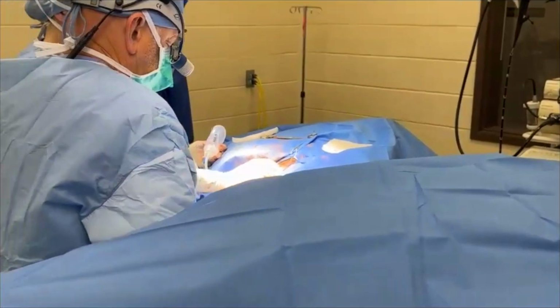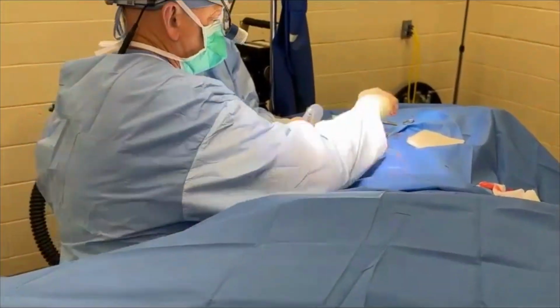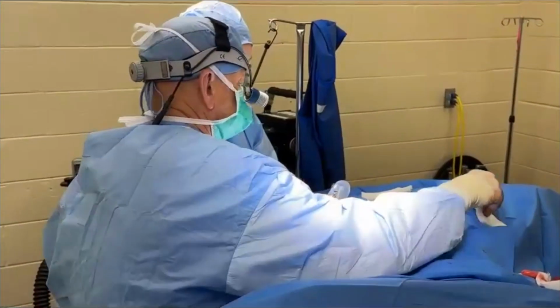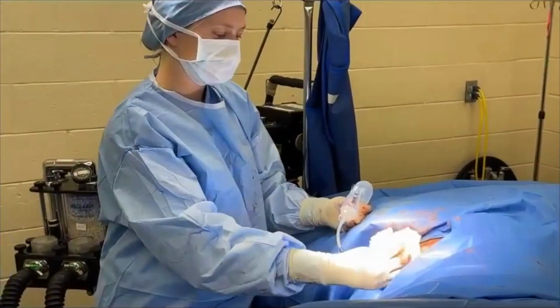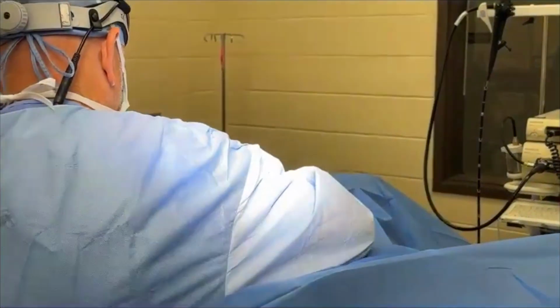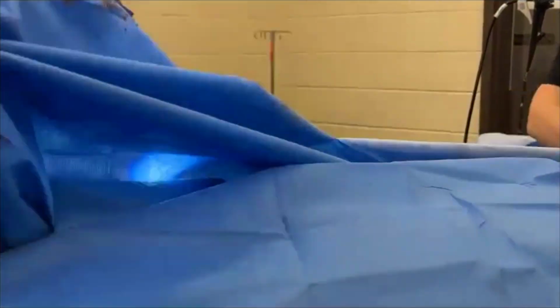Yeah. So we put this suction device on that little tube that you saw. You can see that little plastic thing in her left hand. It's just a thing you squeeze, and then it's got suction in it. Then we usually put just a Coverderm Band-Aid kind of over the incision for recovery. And then oftentimes that comes off after we're done with the recovery.